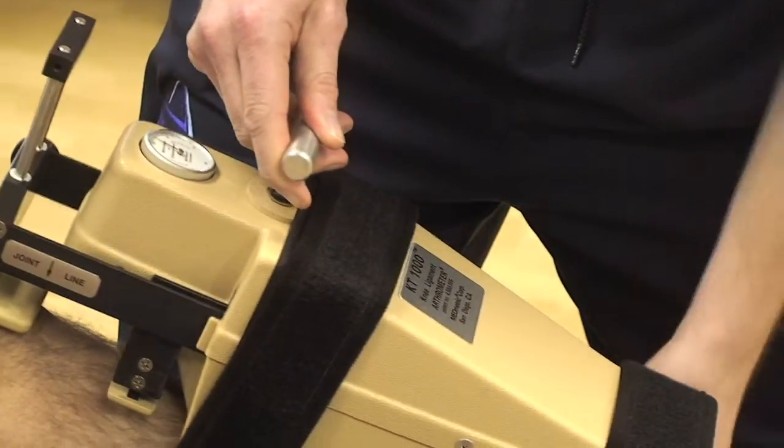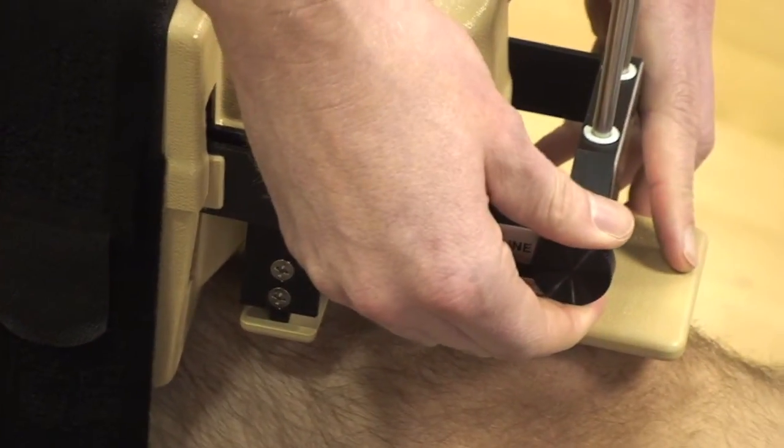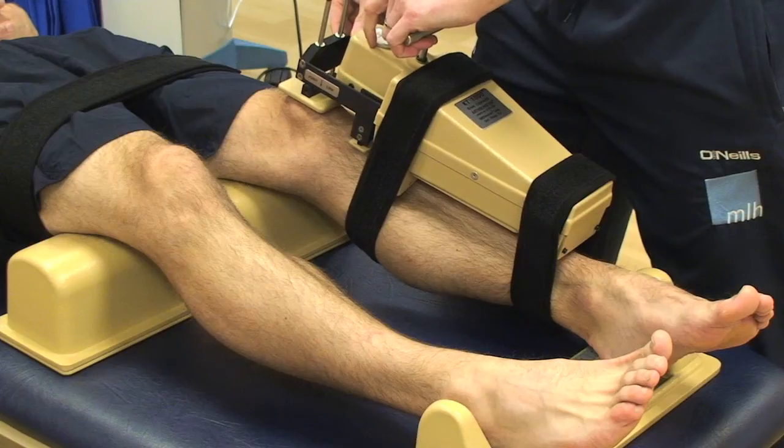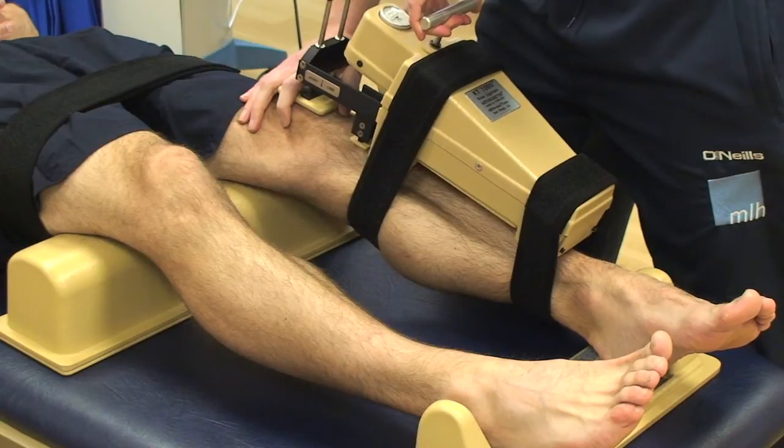The KT-1000 measures how much further one knee moves forwards compared to the other. So if you've had an injury to one knee and they suspect that you've had an ACL rupture, this will tell you in millimetres how much further one knee moves compared to the other.